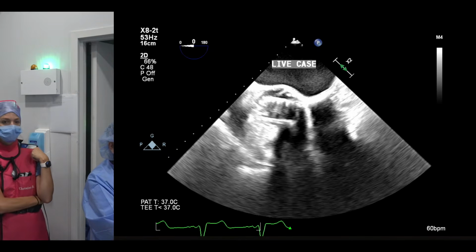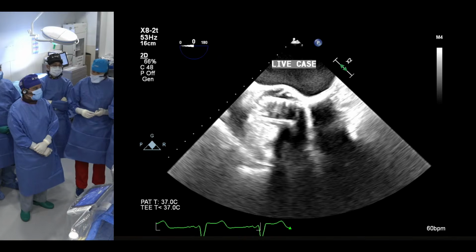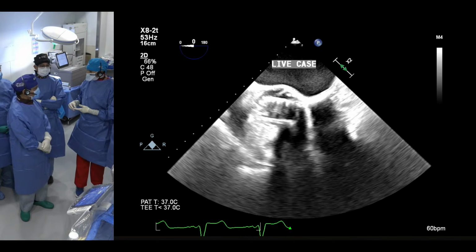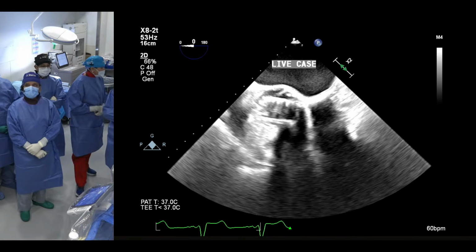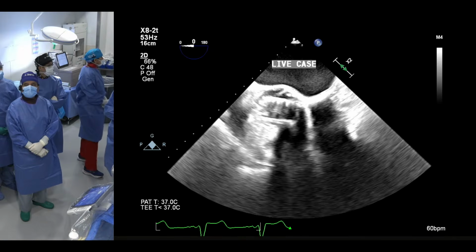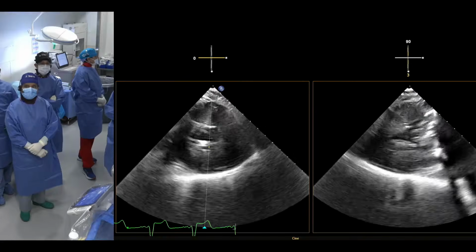So this is what happens. We are seeing the patients in the office. Now we have to talk to the family and the referring physician, and you tell them you need another procedure. You've got to be 100% sure why we are taking the patient back into the room. Let's do the echo now, Stam. Basically, the presentation will match what you see.